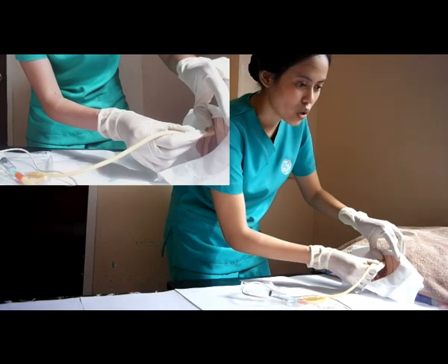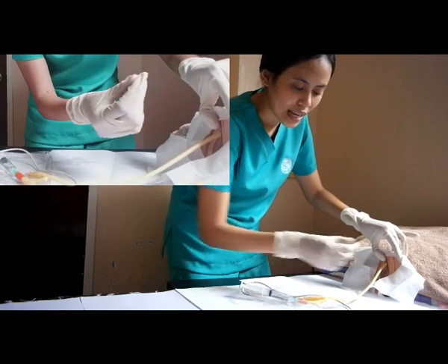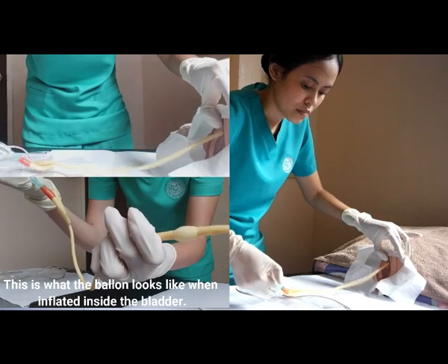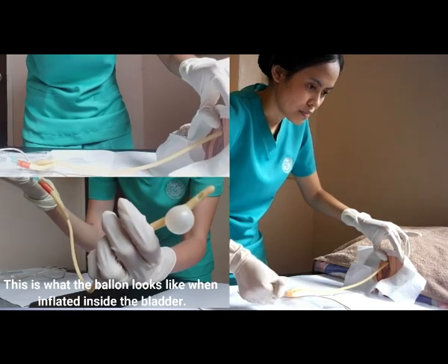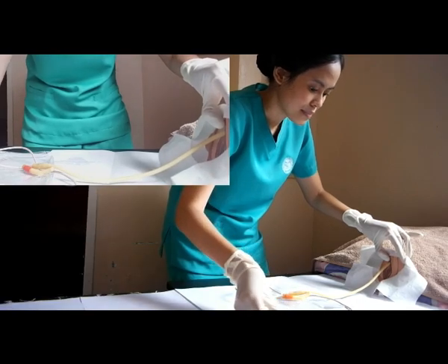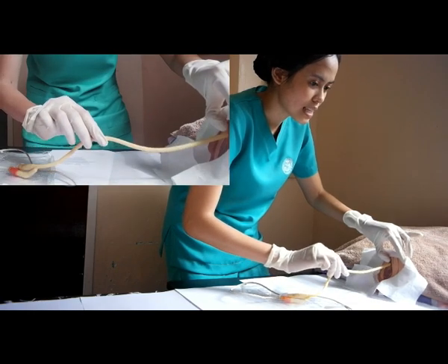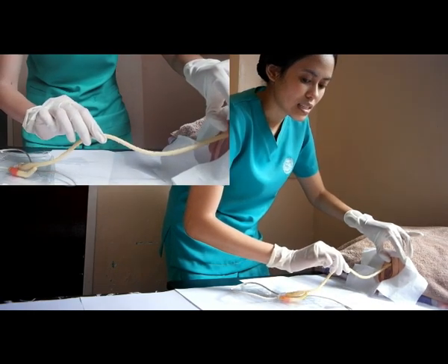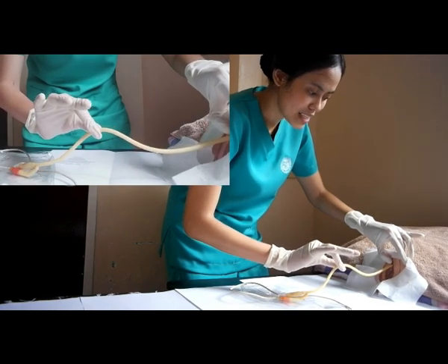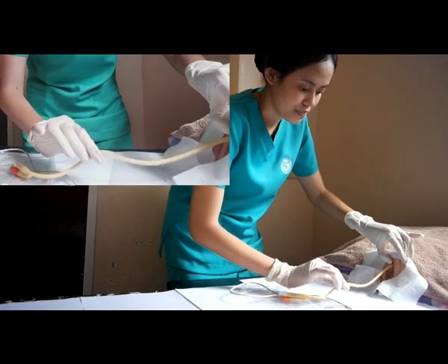After advancing around 1 to 2 inches, we will now be inflating the balloon with your sterile hand. We're going to inflate that with 10 ml. Like that. And you will feel a resistance. If there's a resistance and the balloon and the catheter doesn't come out or move, it means that the balloon is already anchored at the bladder.